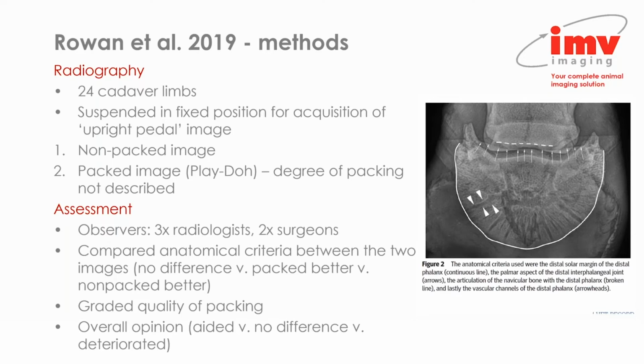However, what they didn't do is detail exactly how they did the packing, who did it, and how much they put in. So for assessment, there were 3 radiologists and 2 surgeons. They were comparing anatomical criteria between the 2 images, and they were asked to grade whether they thought there was no difference in image quality, whether the packed images were better, or whether the non-packed images were better.